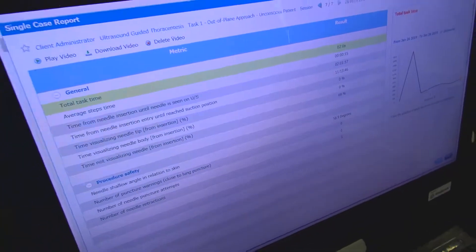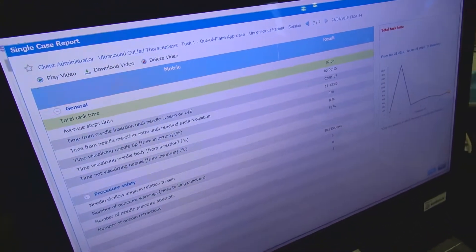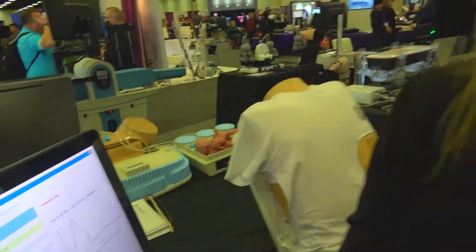All of our systems run on MentorLearn, which is our simulation management system. At the end of any case that you do, you'll get feedback. It'll take screenshots and you can set the benchmarks to assess how the trainee did. You can set them up on a pass-fail, and you can always go back and play back video, download it, and play it in a training environment for others to learn from as well.